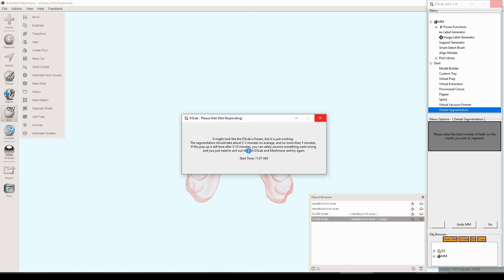This prompt comes up and basically just says it might look like this is frozen but it's just working in the background doing all that number crunching. The segmentation should take about two to three minutes on average but no more than about five minutes. If this is here for more than five to ten minutes then you're probably safe to assume that something went wrong, and at that point you can just exit out of both MeshMixer and D3Lab. To be quite honest that's never happened to me yet where it just times out. If anything it'll just close that prompt and give you some error, but it hasn't really timed out on me yet.